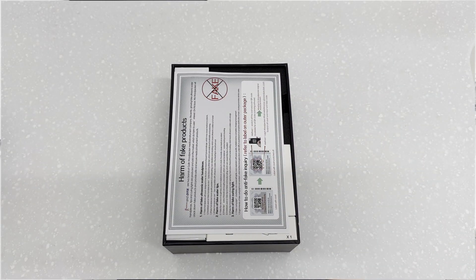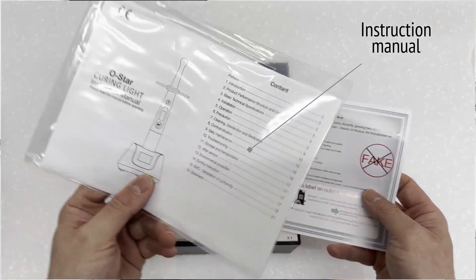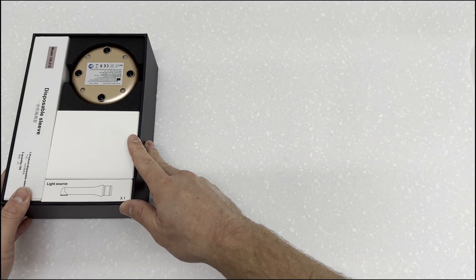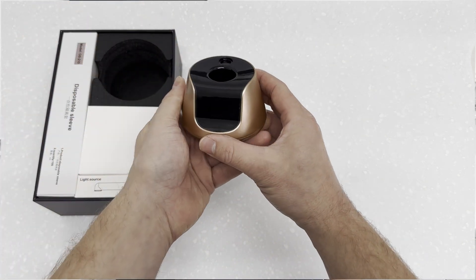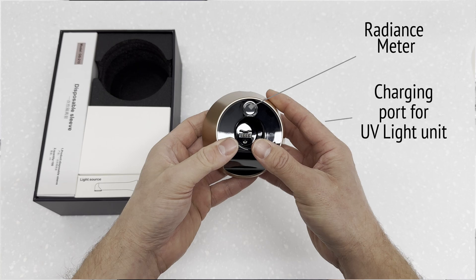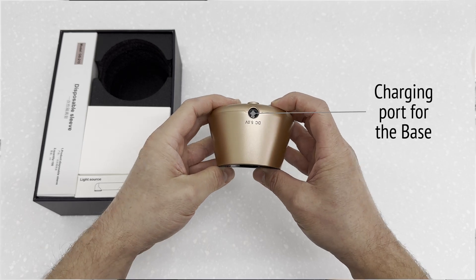The first thing presented once the box is open is a certificate of authenticity and the instruction manual. Next we have the charging base, and we come to the first unusual characteristic of this product: a radiometer, which measures the UV light intensity of the curing light, as we will demonstrate later. At the back is the charging port to plug the base into the wall.